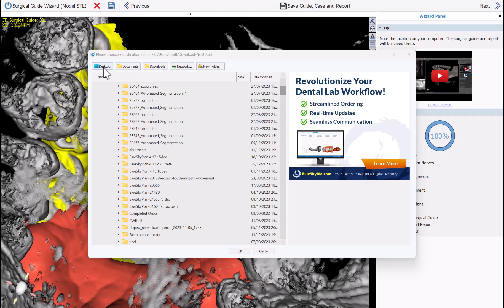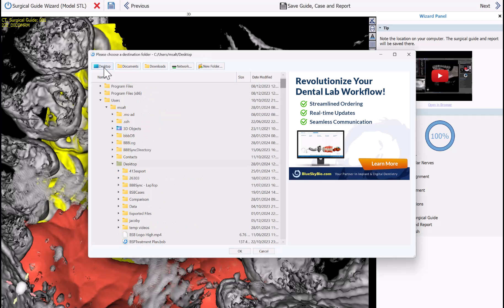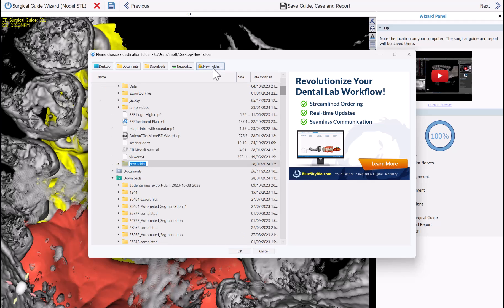The software is now prompting you to save all the relevant data files. I suggest clicking a location on your computer, creating a new folder, and giving it a name. The software will save to that folder the surgical guide, the case, and the drilling report. Create a folder and click OK.